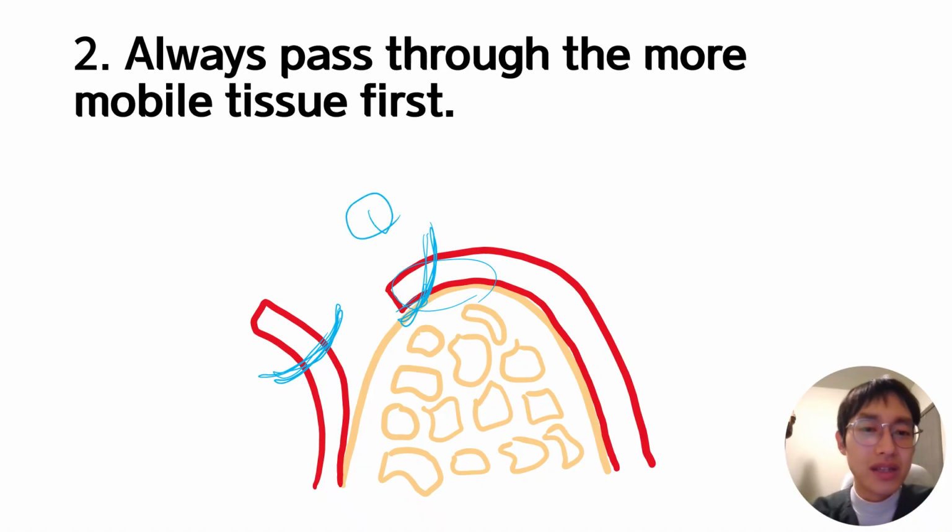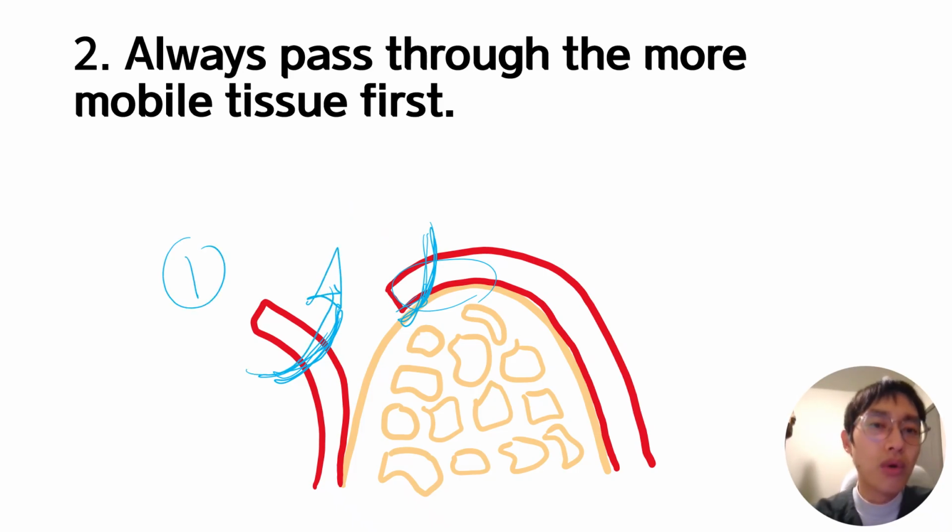The attached one, don't hook it first, okay? Always hook the mobile one, or the more mobile one, and then do the attached one so that you will have a much easier suturing time. Okay.